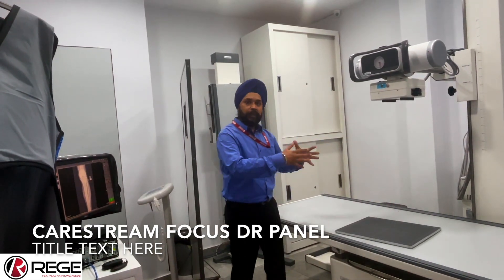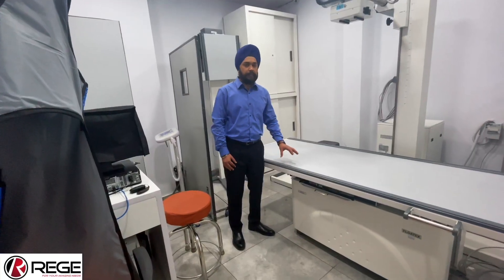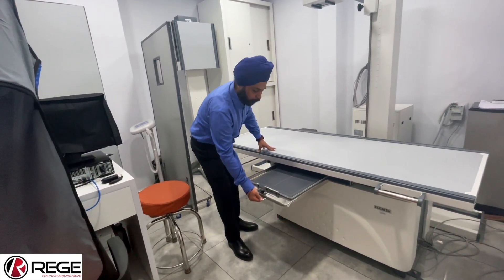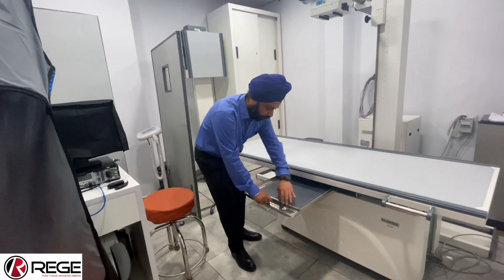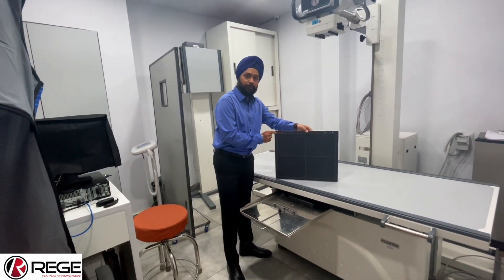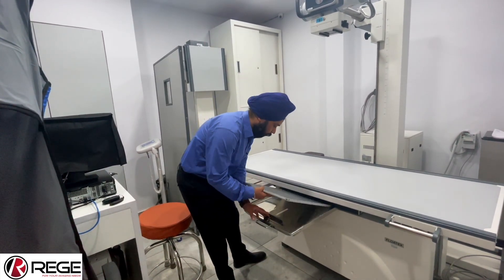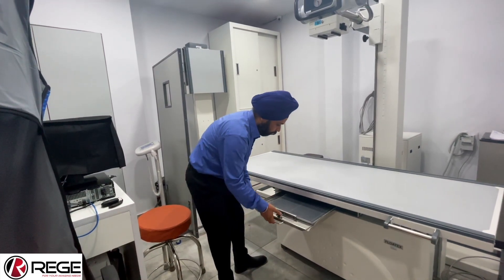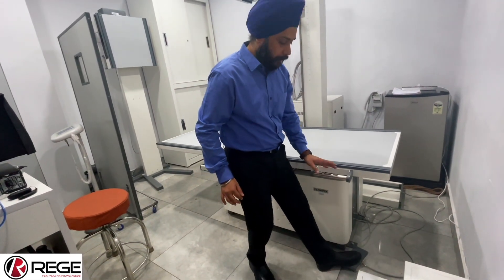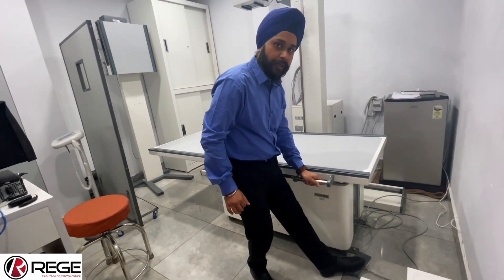Now I will give you a brief demonstration of all of these parts together along with the control panel. This is the Epsilon floating top table. Here we have the bucky grip, and you can see the detector installed in here. This is the K-Stream 14 by 17 detector. Now I will show you the movement of the table itself — here is the foot switch and this is the handle. By pressing the foot switch, you can see how conveniently I can move the table all across.